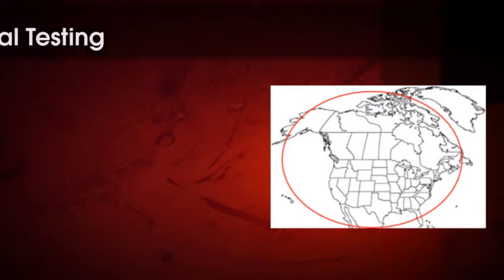Molecular testing for GI pathogenic protozoa is an emerging diagnostic field that has shown tremendous improvements in both specificity and sensitivity over the conventional GI parasite testing. This has been shown in many clinical studies. While conventional ova and parasite exam cannot be completely replaced by a molecular test, molecular tests are designed to augment the testing for the most common GI protozoal pathogens. These tests are valuable tools in the diagnosis of GI pathogenic protozoa that are found in patients in North America.